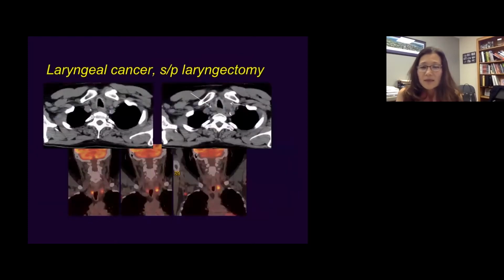Head and neck FDG PET is another one, because FDG PET is heavily involved in all oncology imaging. And I think PET is great, particularly with PET CT, where you can localize the area of abnormality on the cross-sectional imaging. This is a patient with a paratracheal or level 6 lymph node metastasis. Notice there is FDG PET uptake. And I think this one you can call based on the CT scan alone. I don't think we'd call that normal.